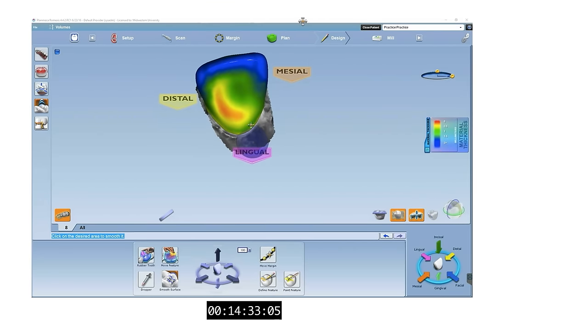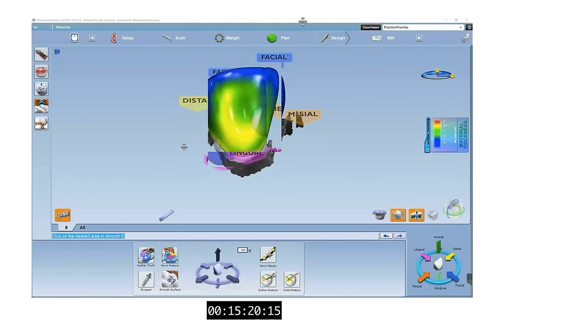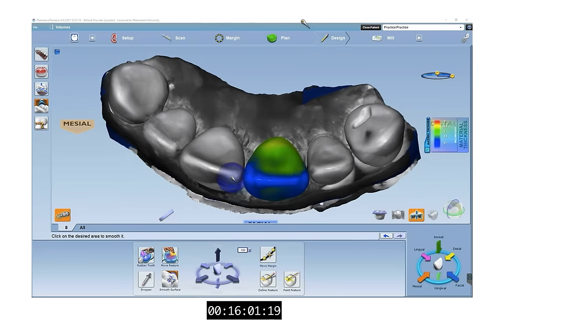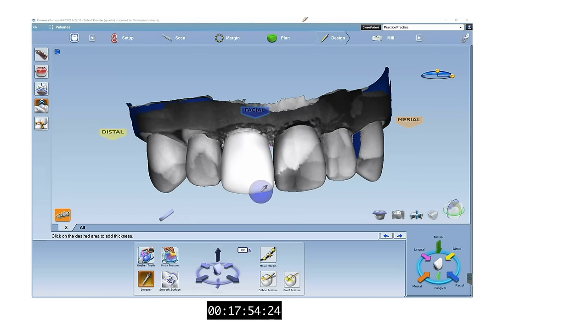To ensure that we provide the patient with a crown that can withstand everyday use, the crown must be made with minimal material thickness in mind. According to Ivoclar, you want your margin to be at about one millimeter, your facial and lingual reduction at about 1.2 millimeters, and your incisal reduction at about 1.5 millimeters for anterior Emax crowns. The dialog below deals with margin ramping — the percent indicates how much of the tooth margin is in contact with the crown versus cement.